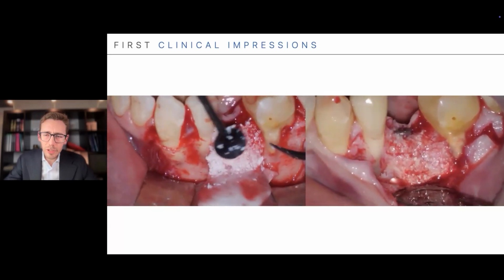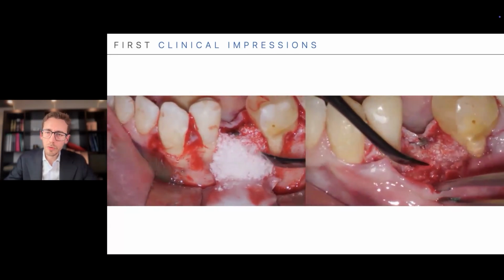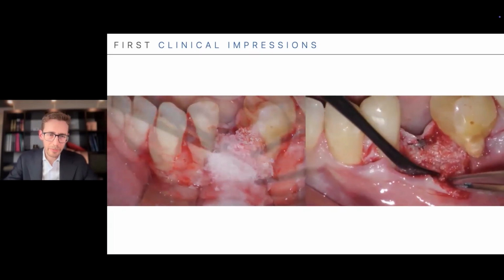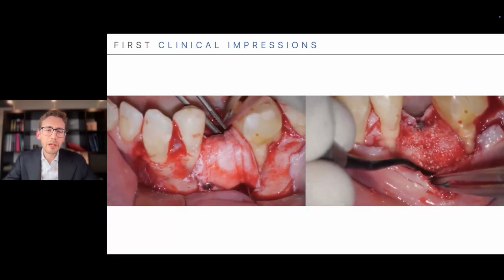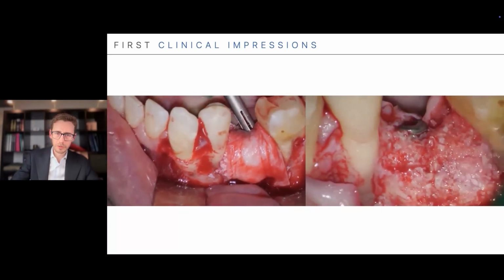And you see at the re-entry procedure 6 months down the road, a very satisfactory amount of bone gain, but most of all, a bone quality which I like very much, with a very vascularized bone, which typically I used to see with the application of an abundant amount of autogenous bone.